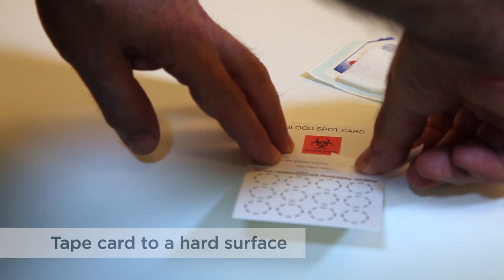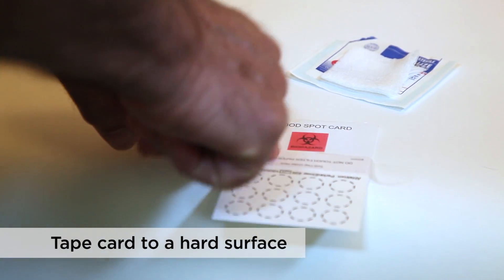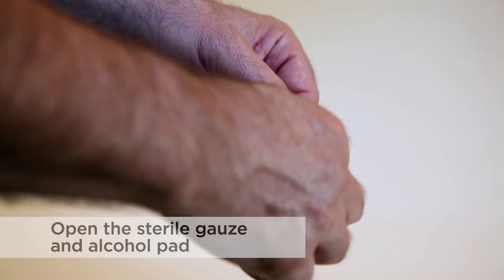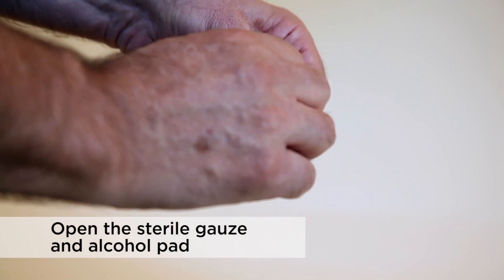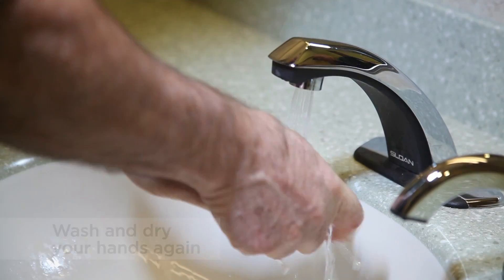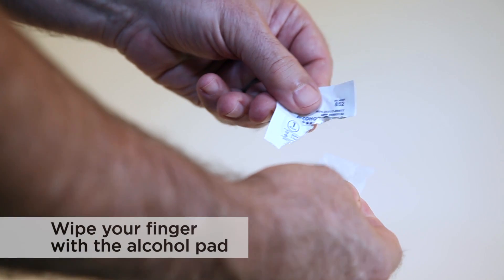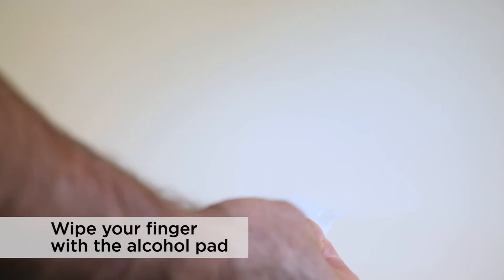Tape it to the surface, such as a table or sink basin, with the inner collection filter paper facing out. Open the sterile gauze and alcohol pad for blood collection, such that they are ready for use. Wash and dry your hands again, and then use the alcohol pad to wipe the fingertip to be used for collecting blood.